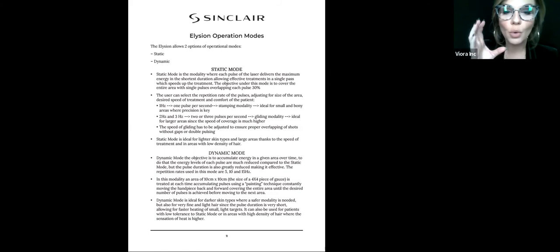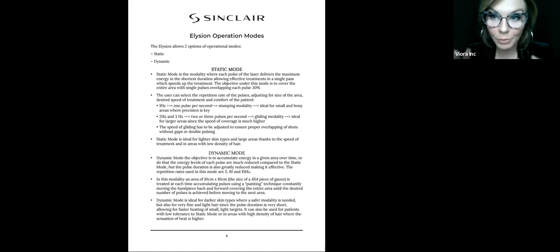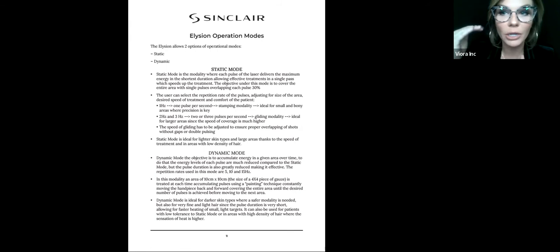There are 3 options of hertz here: 5, 10, and 15 hertz. There's a big difference, 15 pulses per second for 15 hertz. So much quicker, but it's using much lower energy. To compare, if you're treating me, a skin type 2, in static you may be at 20 joules, whereas in dynamic you would only be at about 9 joules. You still get to my endpoint; it's just an accumulation over a period of time.